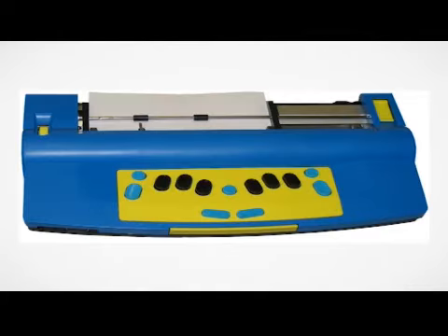The other common device is the mechanical Braille writer. The Braille writer has 6 keys, one for each dot in a Braille cell, a space bar, a backspace key, a carriage return, and a line feed key. Braille writers use heavy weight paper. BrailleNote is a portable computer made by HumanWare and can be used with either a Braille or QWERTY keyboard.